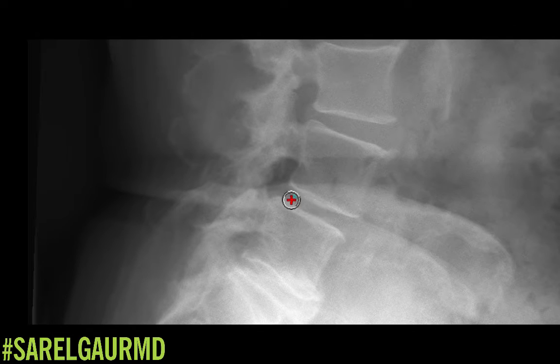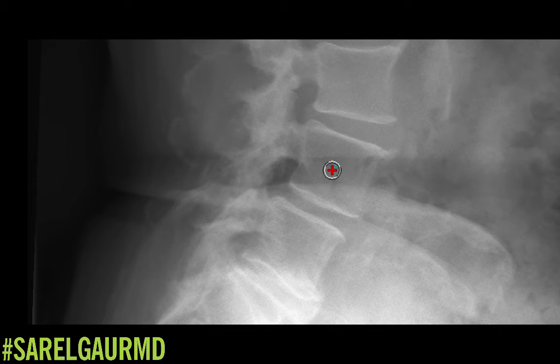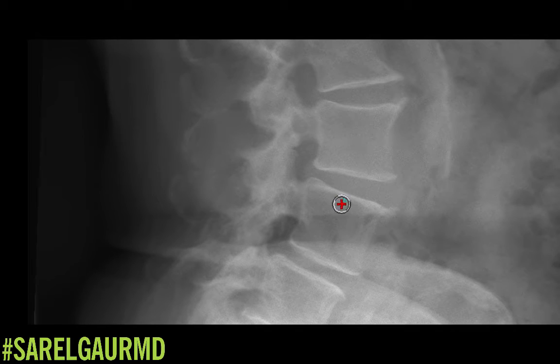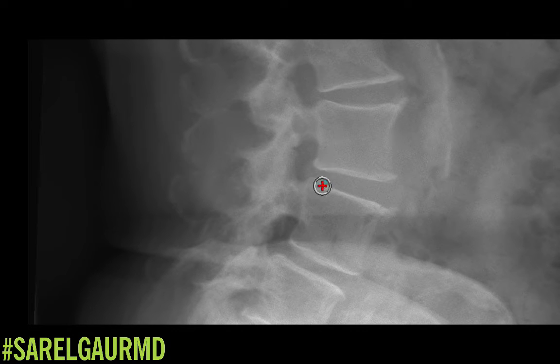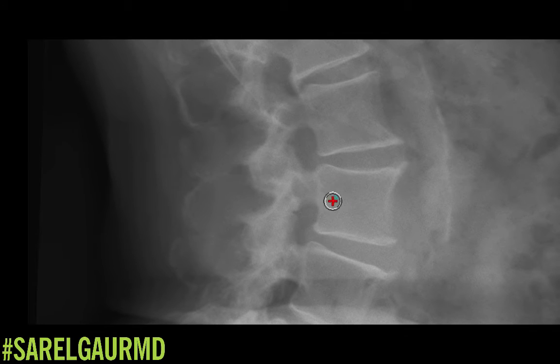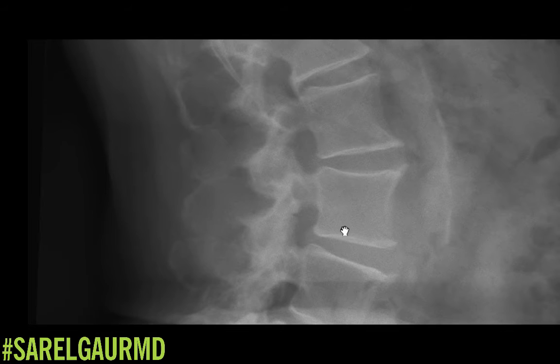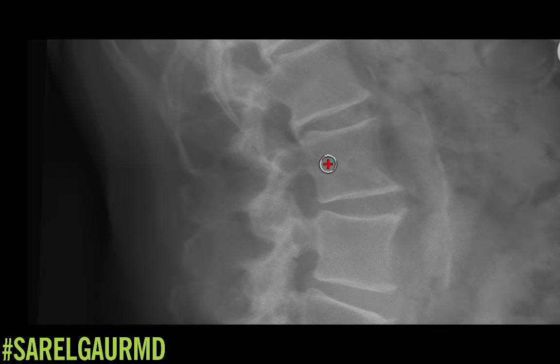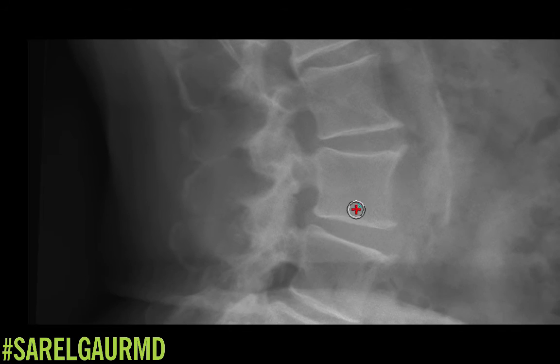Coming to L4-L5, there's definitely at least moderate height loss of this disc. At L3-L4, there's what I would call posterior disc space narrowing, or disc volume loss posteriorly, at least to a moderate degree. Maybe the same thing at L2-L3 and L1-L2. So definitely some multi-level disc height loss.